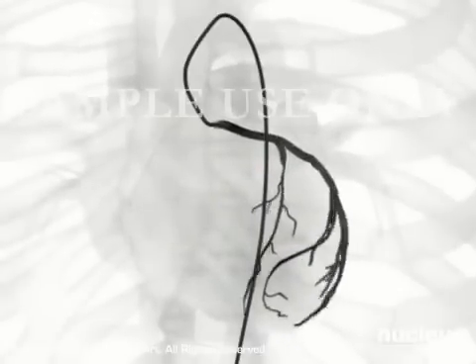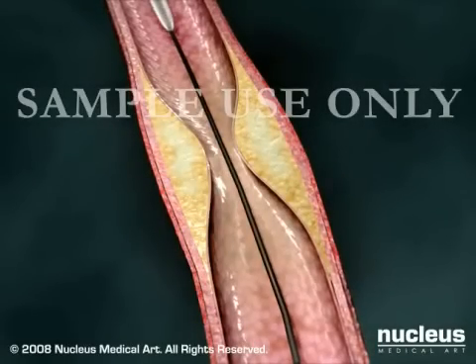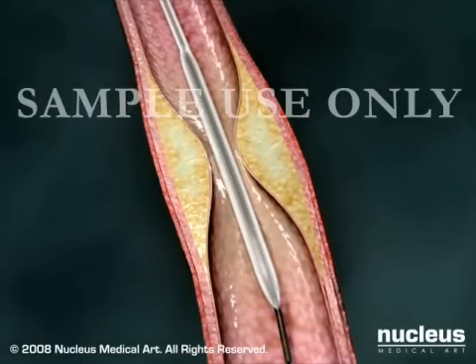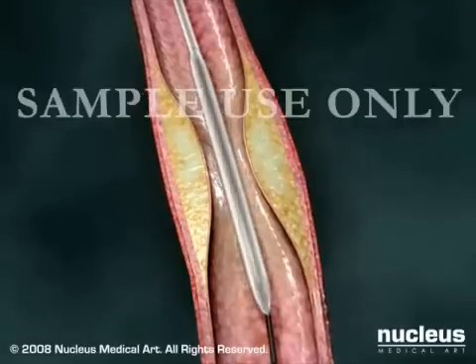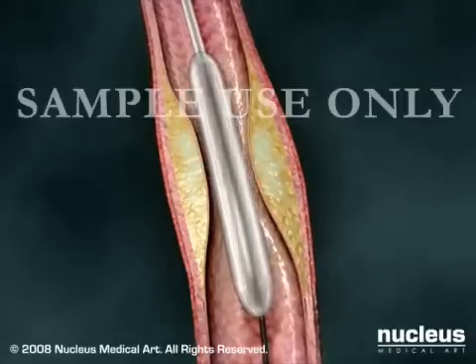You may feel flushed or slightly nauseated when the dye is injected. Once the blockage is identified, your doctor will insert a flexible guide wire into the artery and advance a balloon-tipped catheter over this wire and into position at the site of the blockage. Rapid inflation and deflation of the small balloon pushes the vessel wall out, re-establishing blood flow through the artery.